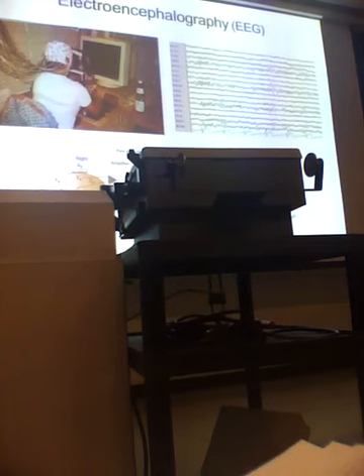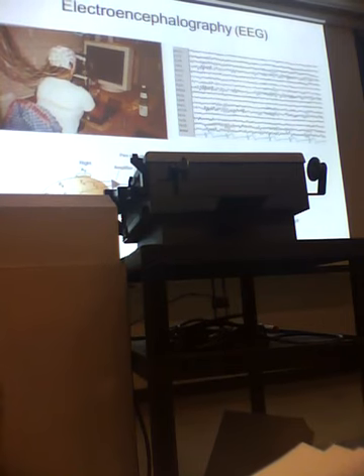So electroencephalography. This is an old and very common technique. Might be used in sleep studies. Let's say you've got a patient that's got really bad sleep disorders, or you suspect they might have narcolepsy or something like that. Then they might go to a sleep clinic and have an electroencephalography study where they put these electrodes on the skull and get them to sleep, and with certain sleep disorders you'll see very abnormal patterns of electrical activity. So in electroencephalography, EEG, you can place a large number of electrodes. You don't have to have as many as this necessarily, but quite a few.